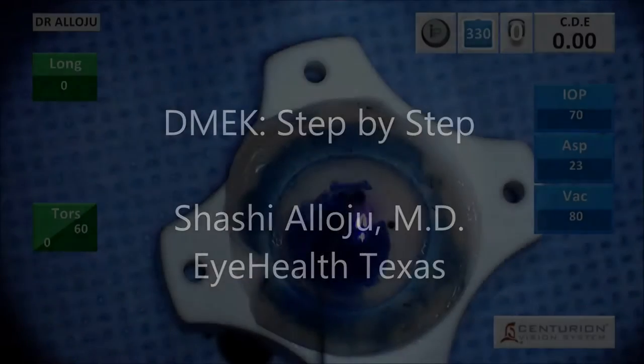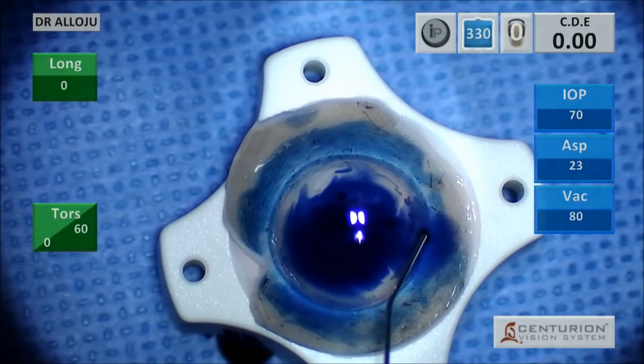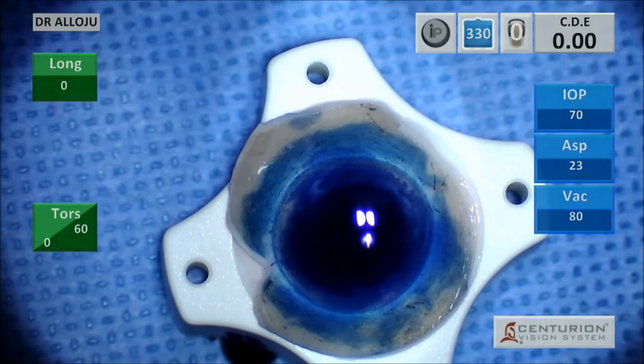I wanted to share a step-by-step DMEK video on essentially how I do DMEK surgery now. So this is DMEK alone and not a DMEK combined with a cataract. We start here with graft preparation.